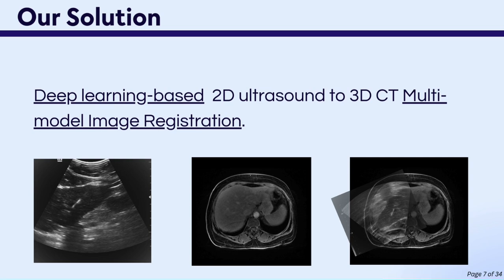To address these limitations, we leverage deep learning for 2D ultrasound to 3D CT multimodal image registration. Deep learning offers the ability to handle diverse imaging modalities by learning robust feature representations, enabling precise alignment and improving surgical accuracy without the need for additional tracking systems.